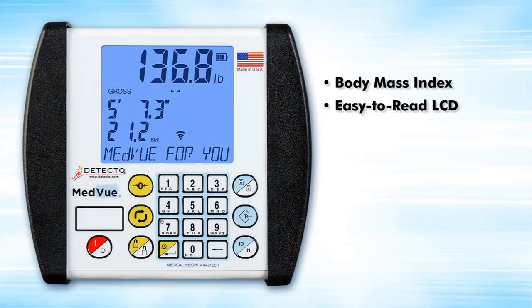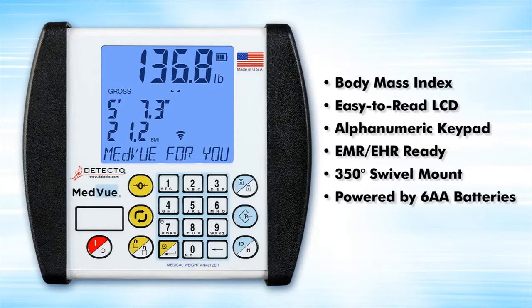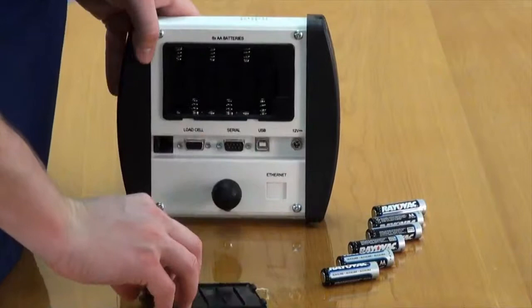The 6550 is equipped with Detecto's MedVue indicator, which features body mass index calculation, an easy-to-read bright blue display, alphanumeric keypad, and is EMR-EHR ready. The MedVue comes with a 350-degree swivel mounting bracket and is powered by six AA batteries or an optional AC adapter.